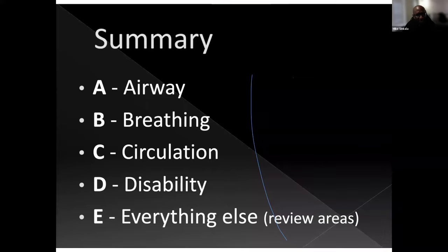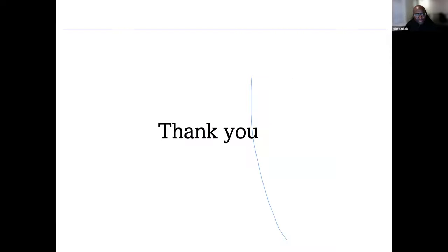So in summary, use the A, B, C, D, and E to review your areas: airways, breathing, circulation, disability, and everything else. Ladies and gentlemen, thank you very much. I end my presentation. Any questions?